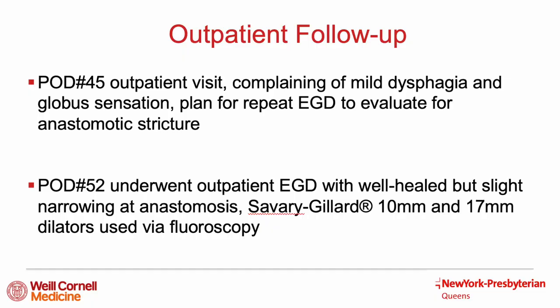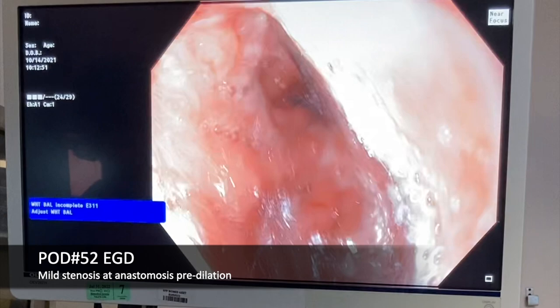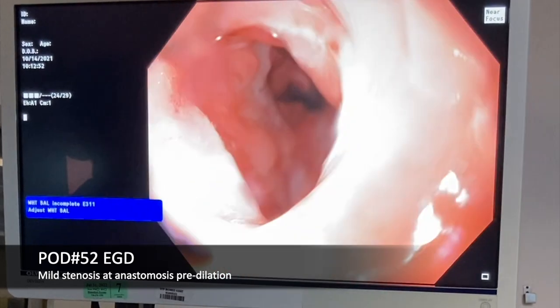On postoperative day 45, the patient returned to the office complaining of mild dysphagia and globus sensation. On postoperative day 52, he underwent outpatient EGD, showing a well-healed but slightly narrowed anastomosis. Endoscopic dilation with 10 mm and 17 mm Savary-Gillard dilators was performed under fluoroscopic guidance. Here is the endoscopy showing the mild stenosis at the anastomosis before dilation.